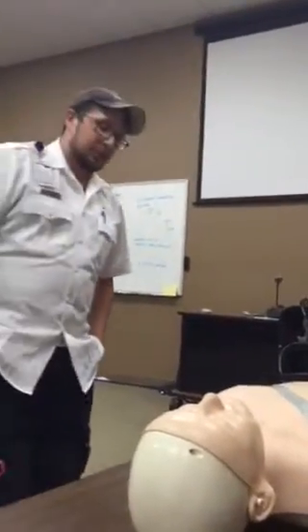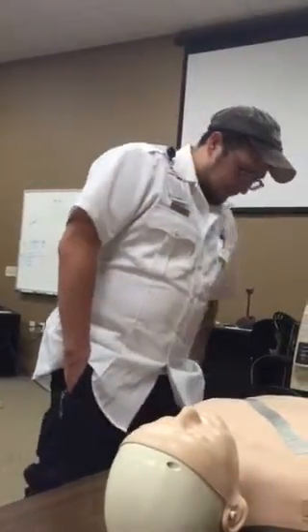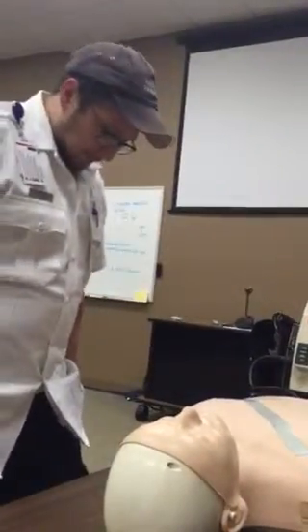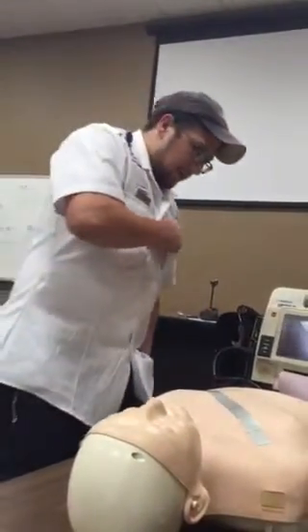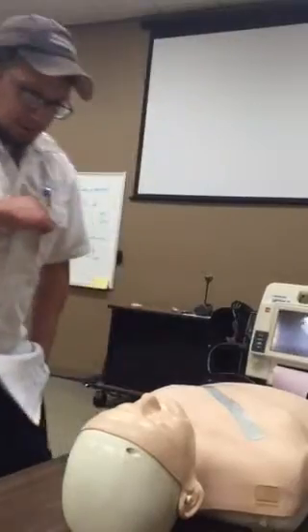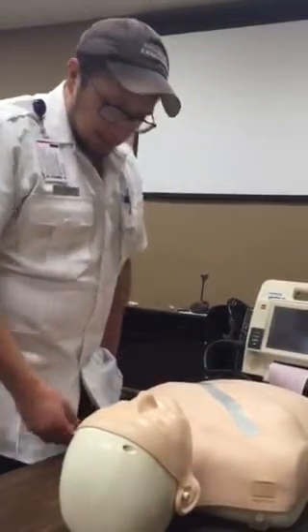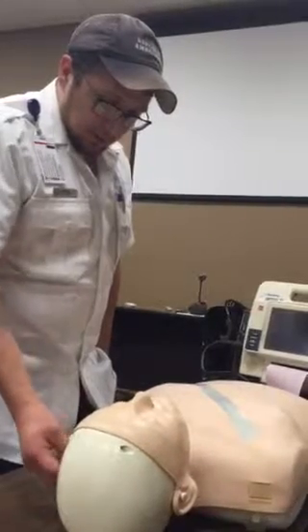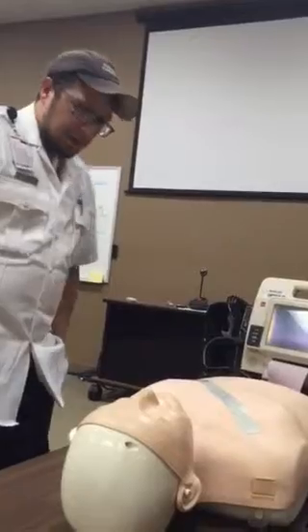This is the dynamic cardiology. Using the AHA guidelines, you will work through algorithms for 4 separate arrhythmias. You will be team leader and voice your interpretation of each arrhythmia, as well as all the basic, advanced, and pharmacological interventions you wish to administer. You'll be using the defibrillator mannequin you see before you and the ECG monitor defibrillator. Do you have any questions on these equipment?